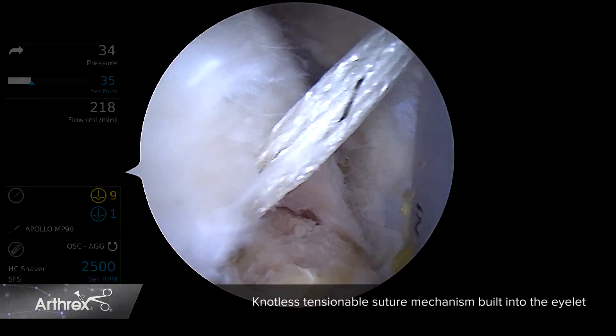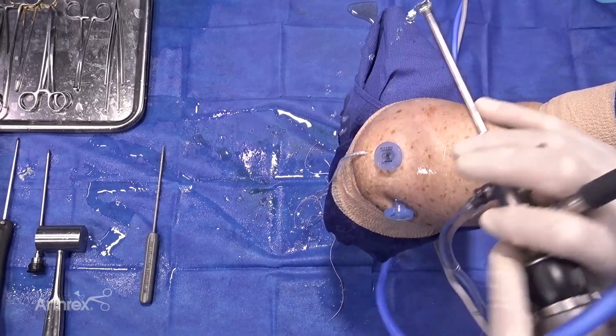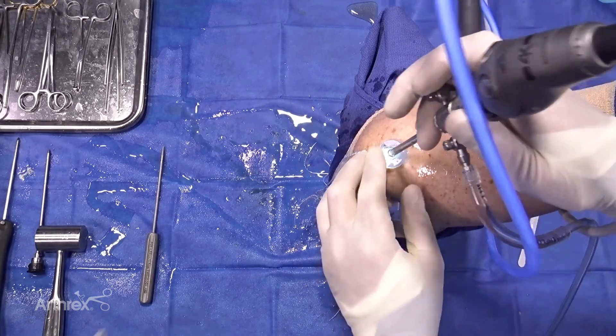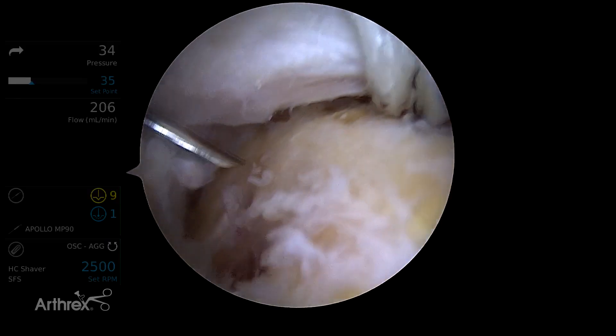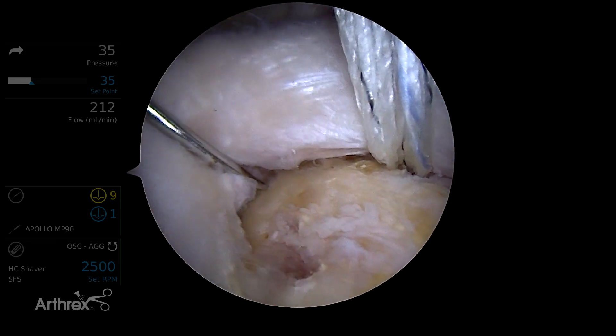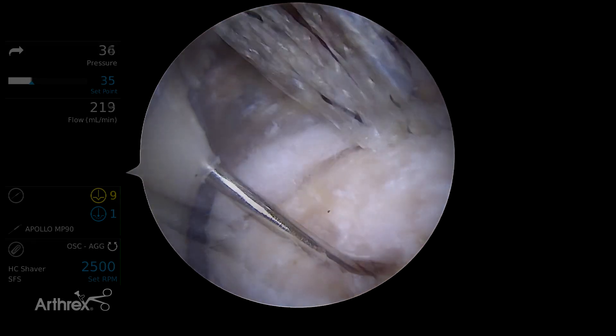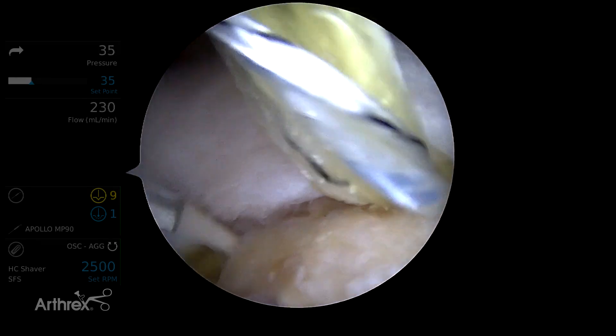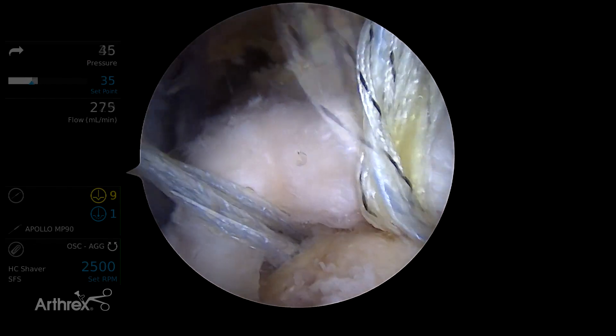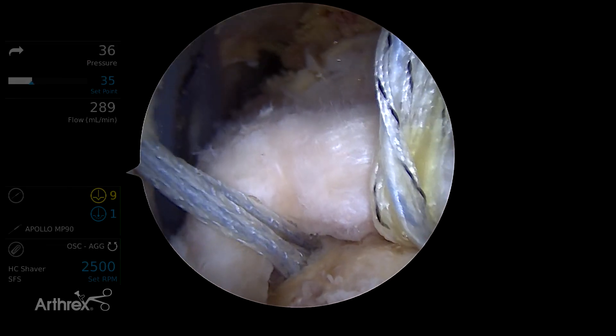Now I'm going to switch to a lateral viewing portal to place my posteromedial anchor, which is also going to be the knotless swivel lock with the self-cinching mechanism. And that looks like that's going to be a good spot right there. This will be our posteromedial anchor. And now we've got our two medial anchors placed.